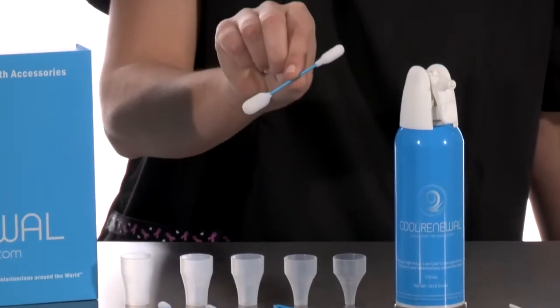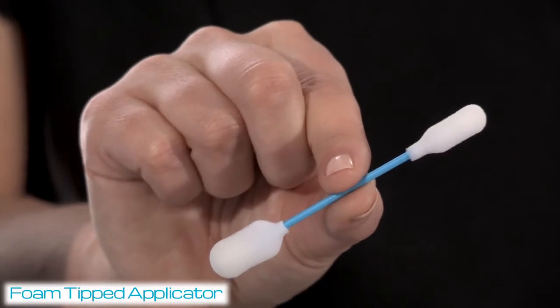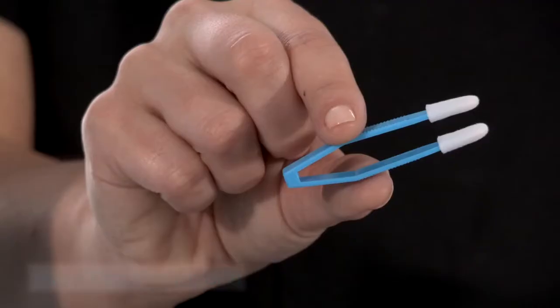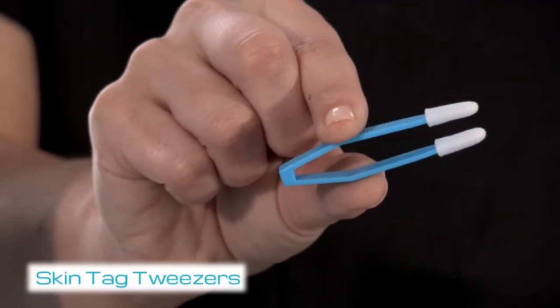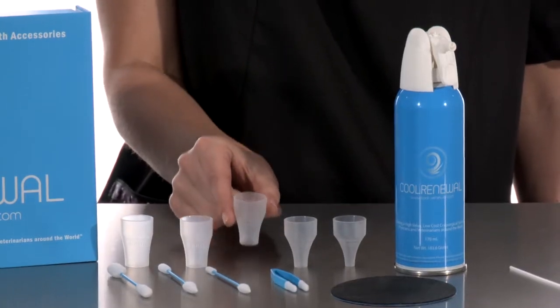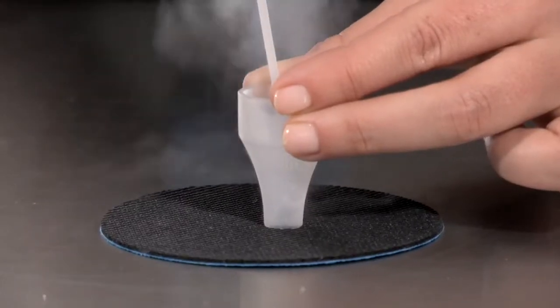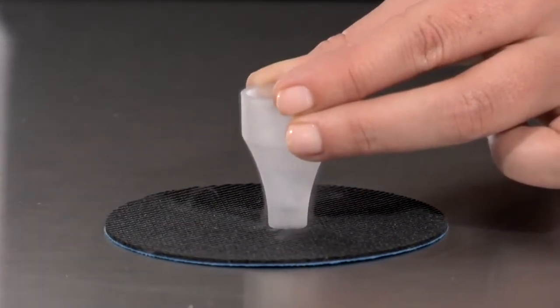Foam-tipped applicators are convenient when treating bony surfaces, hard to reach areas of the body, or lesions on the head, face, and neck. Skin tag tweezers are convenient when treating skin tags anywhere on the body. Isolation funnels are convenient for treating fleshy tissue areas of the body, excluding the head and neck. A tight seal must be achieved for direct application of cryogen to the skin.